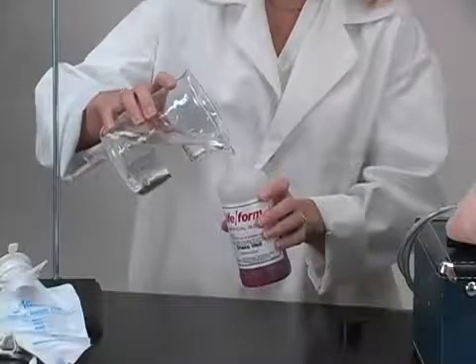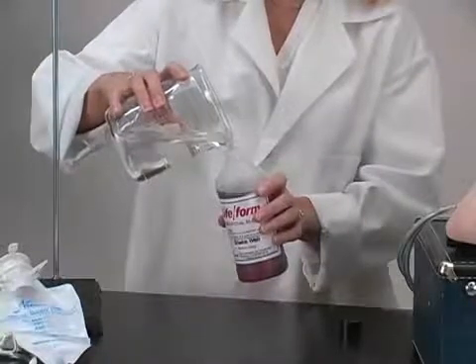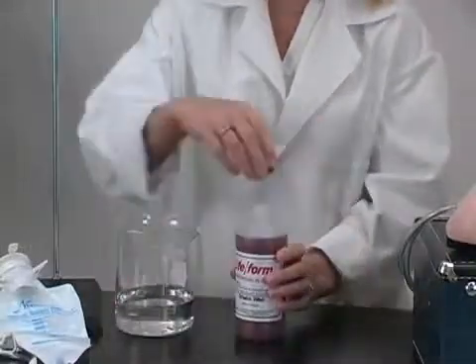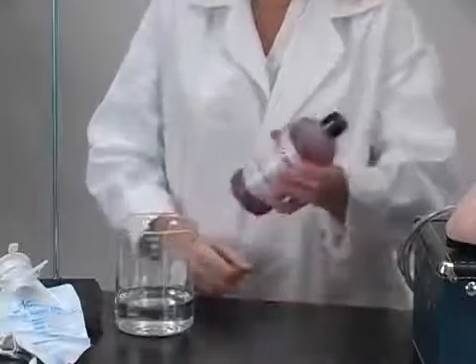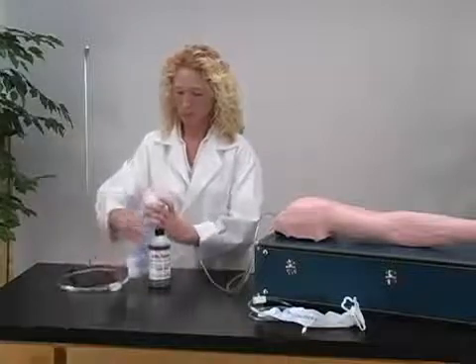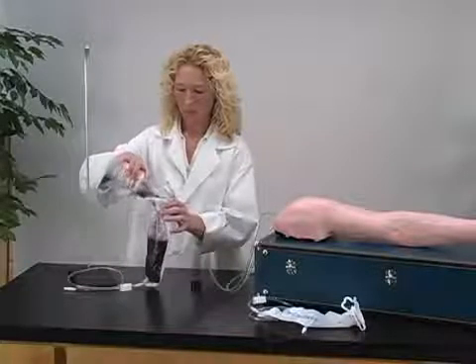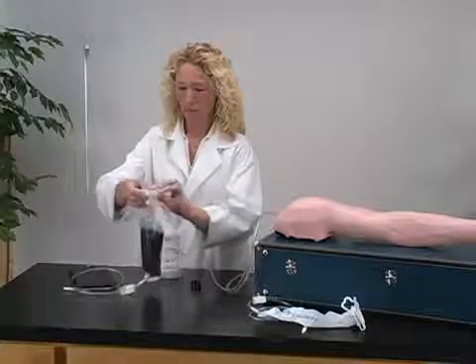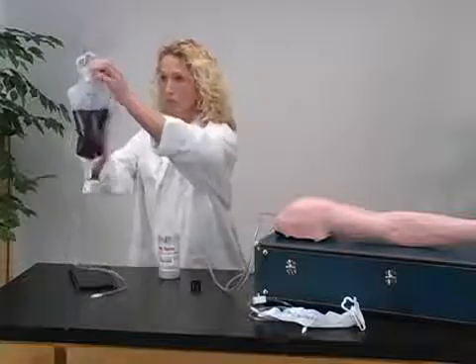The first step in operating a NASCO lifeform IV arm is to pressurize the vein system with synthetic blood. Add distilled water to the synthetic blood concentrate included with the manikin and shake until mixed. Close the clamp on the tubing, then pour the synthetic blood into the IV bag and hang the IV bag on a stand no more than 18 inches above the arm.